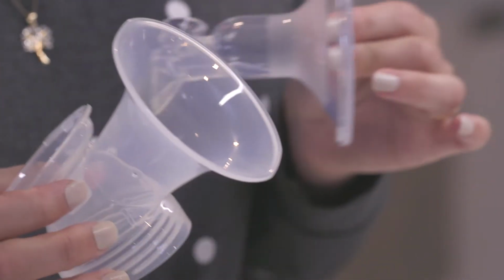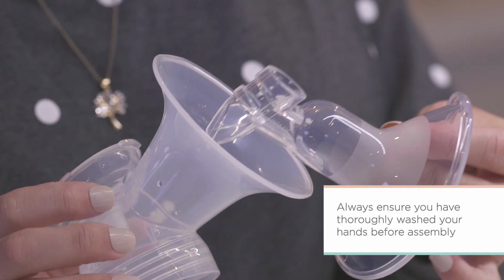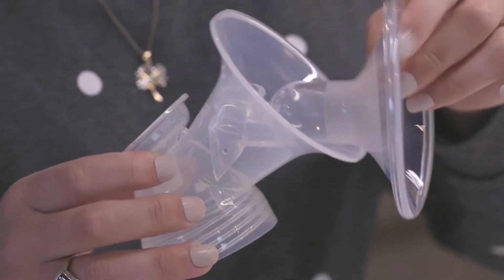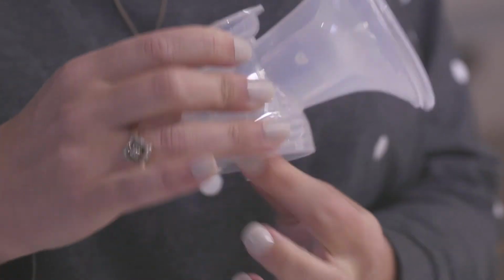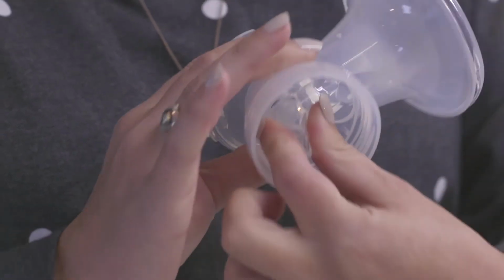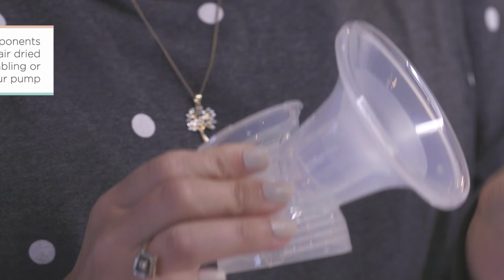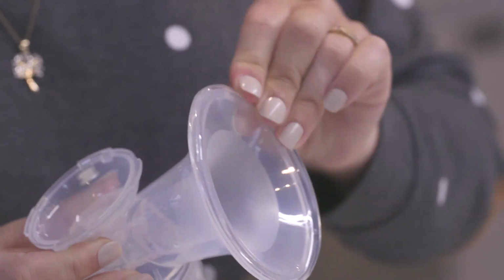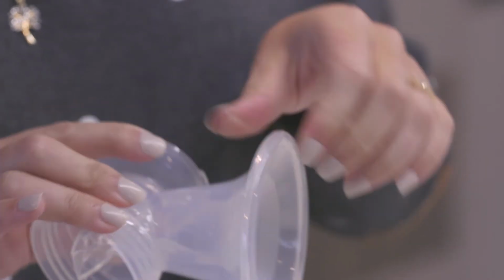So you're going to take your silicone breast cushion and the casing, and put the valve through the centre of the casing, pull it through and just push it down onto the underside plug. And then flip the sides of the silicone cushion around the casing to secure it.